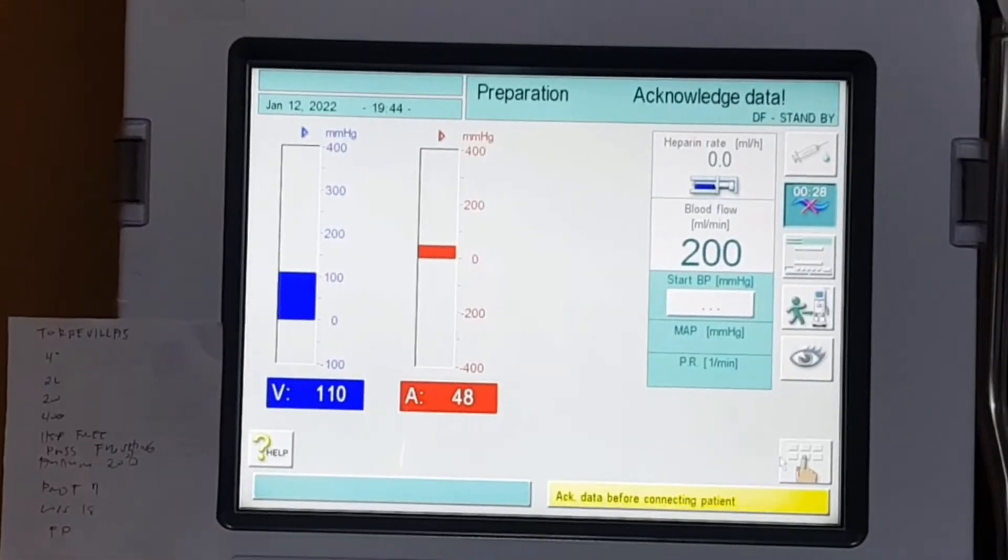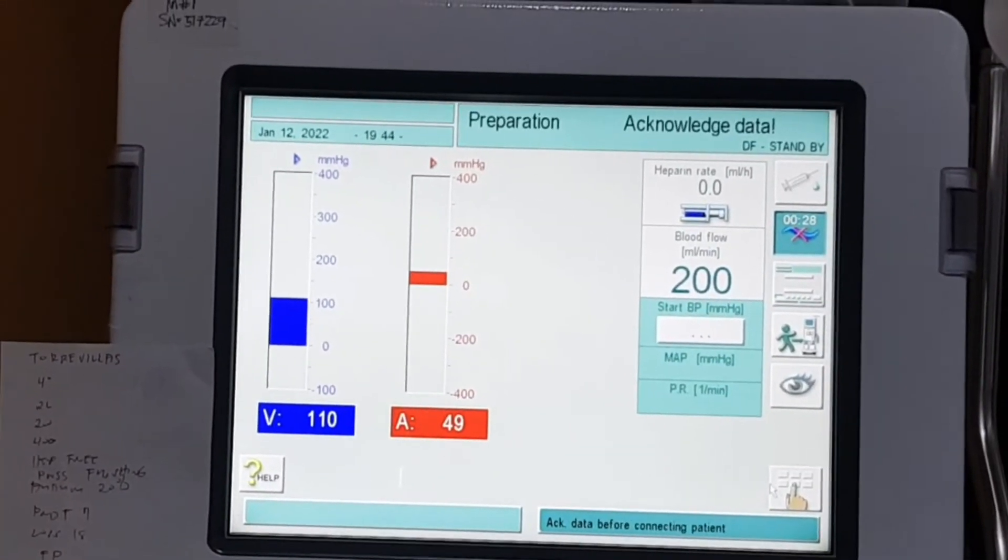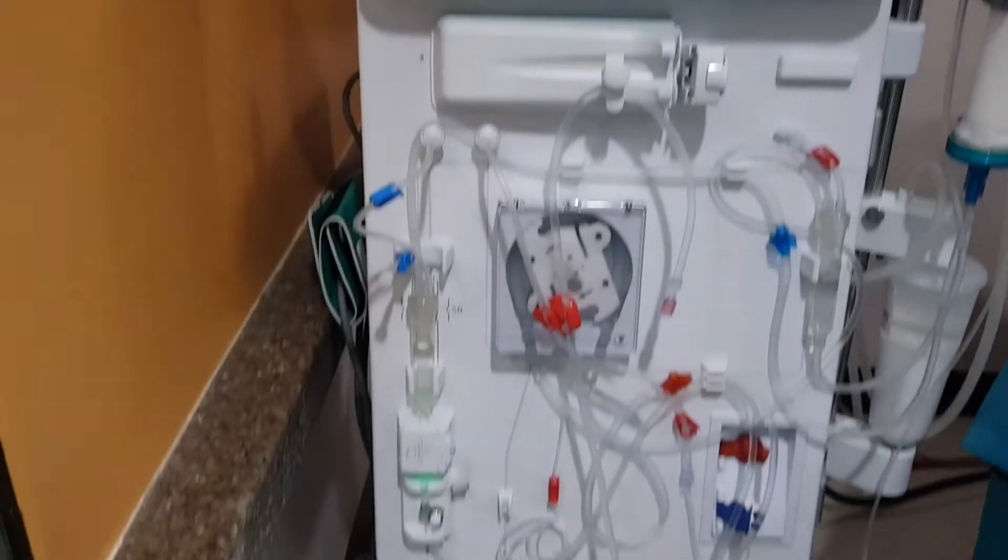I am only here to at least help you familiarize the procedure, because of course you still need to follow the facility's protocol. Today's setup: the patient's access is IJ and the machine is already in acknowledged data mode. Unfortunately, the machine is already ready to hook, so I'm just going to discuss the steps taken before it.